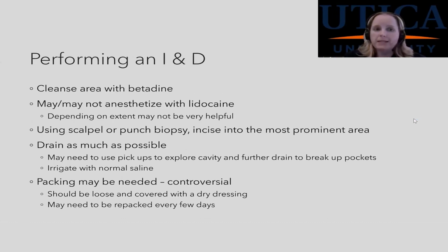So how do you perform an I&D? Clean the area with Betadine, or whatever you're using at your facility, chlorhexidine. You may or may not anesthetize with lidocaine. Sometimes they're so painful that lidocaine really doesn't help. There's just so much pressure, you'll introduce more pressure, so the lidocaine is useless. Really you cut it open, you release the pressure, and things are wonderful. You can use a scalpel or punch biopsy and incise the most prominent area.